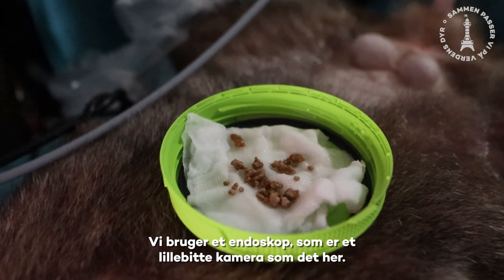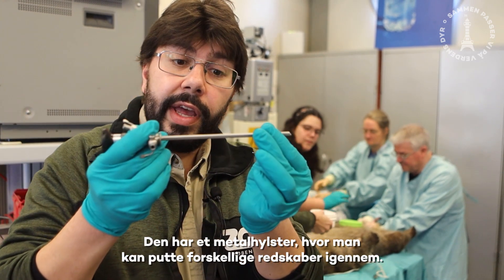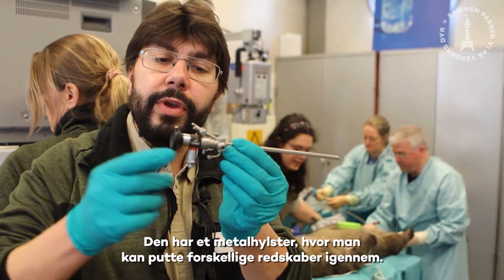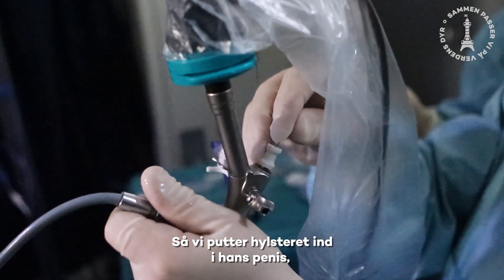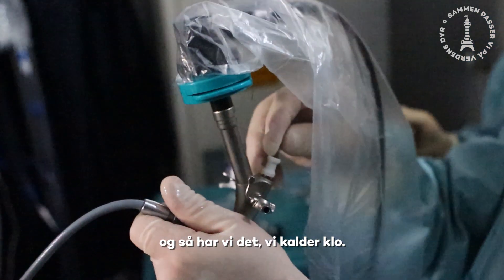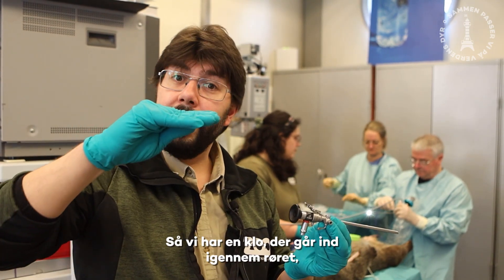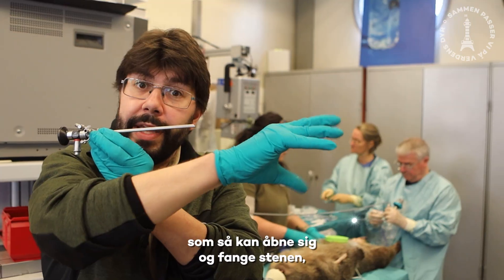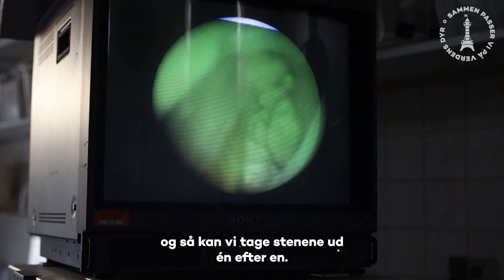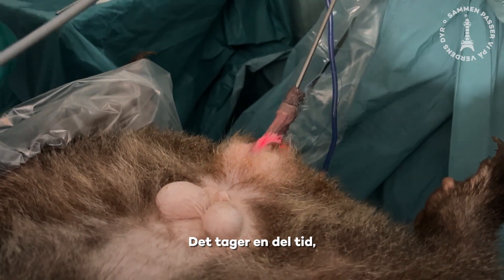So what we're doing today is we're using an endoscope, which is a tiny little camera you can see here, and this is a metal sheath that we have, and we can put various tools through here. We put this through his penis and then we've got a little — what we call a basket — like the things you have in Tivoli that go and grab the toys. We've got a metal thing that goes in through our scope, and then once it's through it opens up, grabs the stone, and then we pull the whole thing out and can remove the stones one by one. It takes a little while, but this is what's going to make Horace feel very nice afterwards.